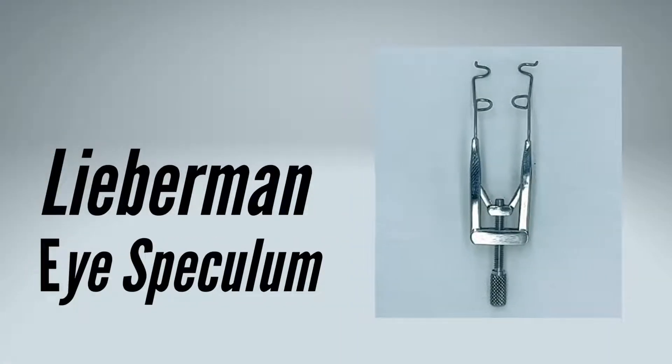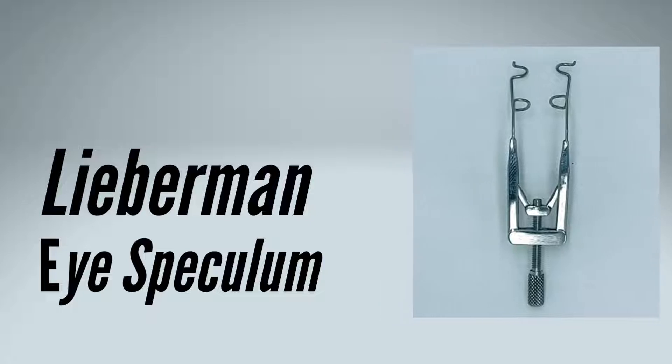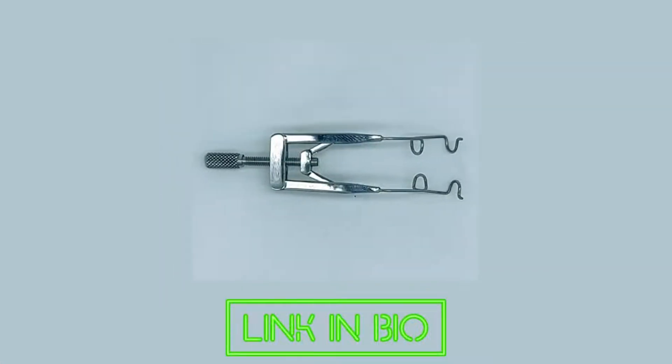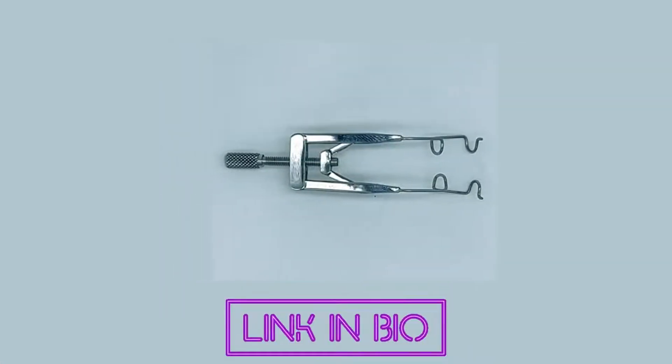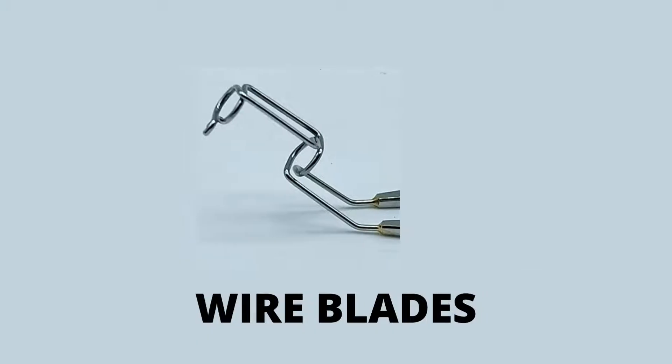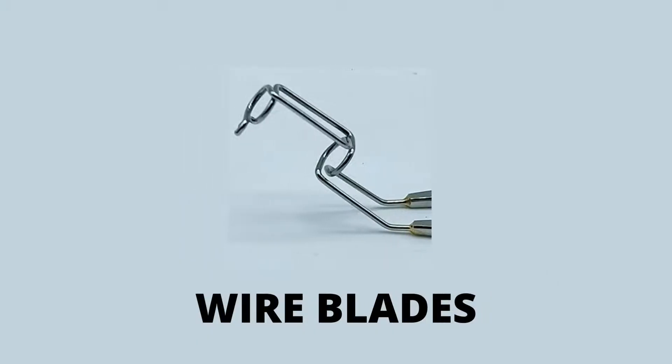The Lieberman eye speculum offers more controlled opening of the eye during surgery. It has wired blades that help in the retraction of eyelids without undue pressure.